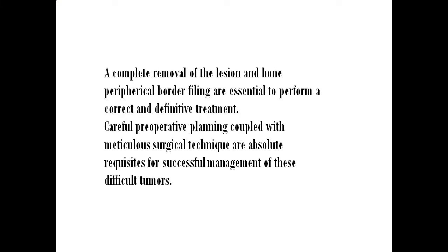A complete removal of the lesion and bone peripheral border filing are essential to perform a correct and definitive treatment. Careful preoperative planning coupled with meticulous surgical technique are absolute requisites for successful management of these difficult tumors. Sinonasal papillomas.